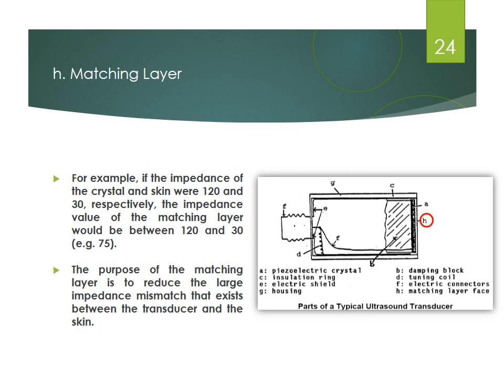To summarize, the matching layer's purpose is to reduce the large impedance mismatch that exists between the transducer and the skin.